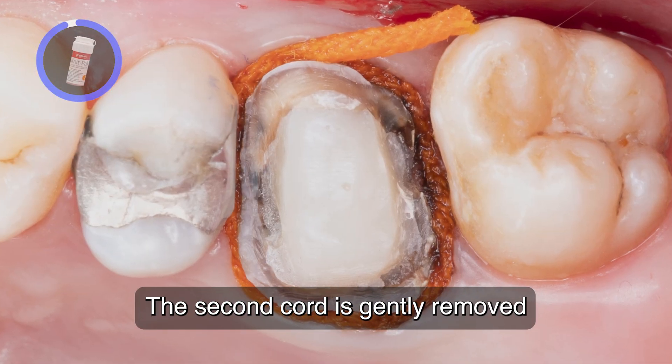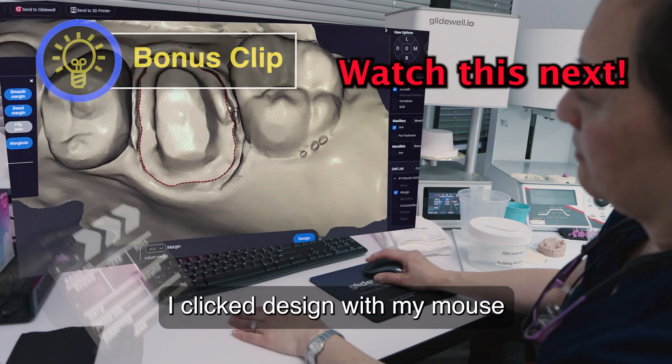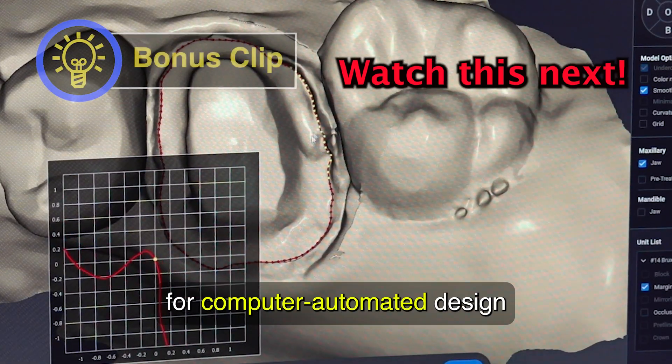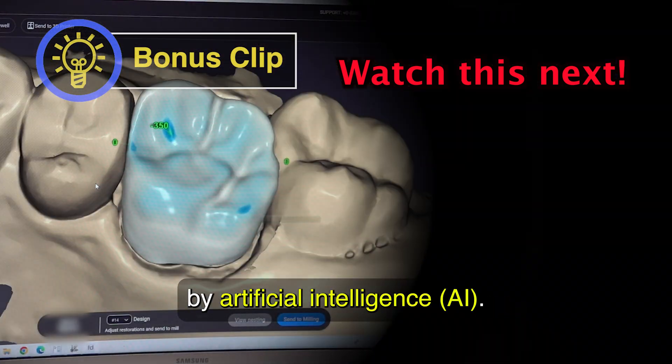The second cord is gently removed and the tooth is dried prior to taking an impression. I click design with my mouse for computer automated design generated again by artificial intelligence.